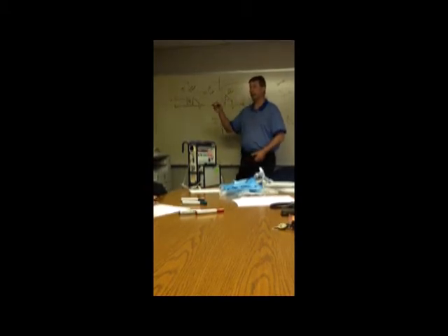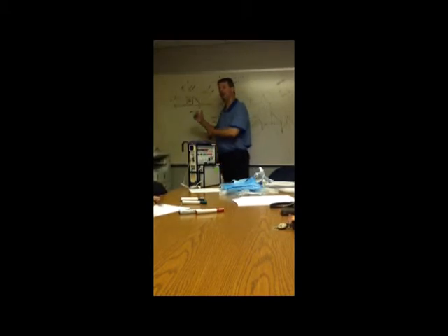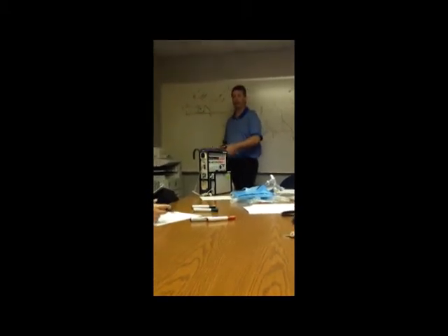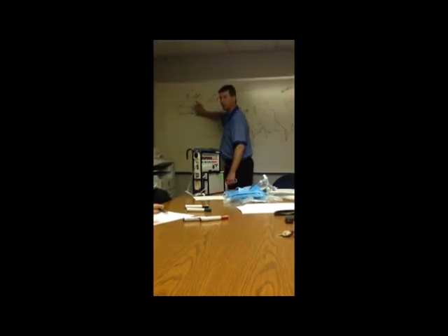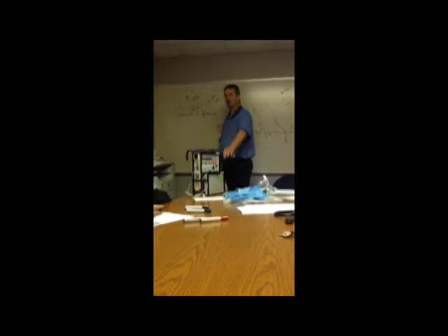If you do it on the other systems, like our machines, and they're on 20/5, if you increase their EPAP to 10, now they're on 20/10. They were getting 15 of a change in pressure, now they're getting 10. We have to compensate with the IPAP if we change our EPAP to keep the help with each breath the same. Your machine, you don't have to do that because you've dialed in that. You're setting the help you're giving them, not the total pressure. We set the total pressure, not the help. So we have to adjust it.